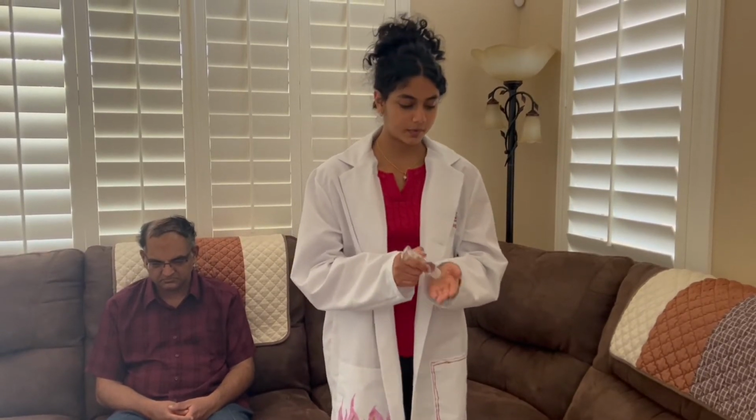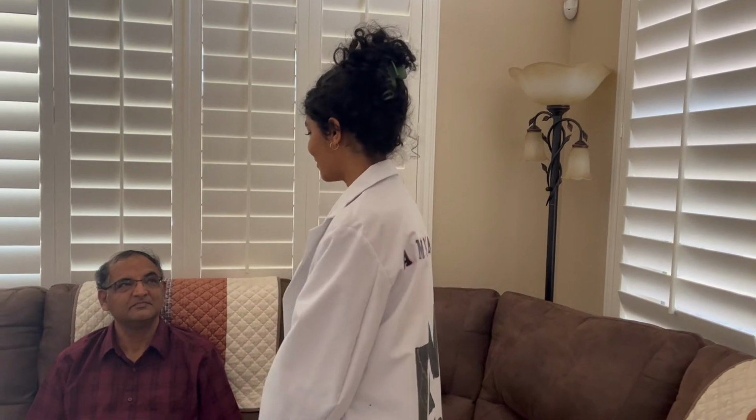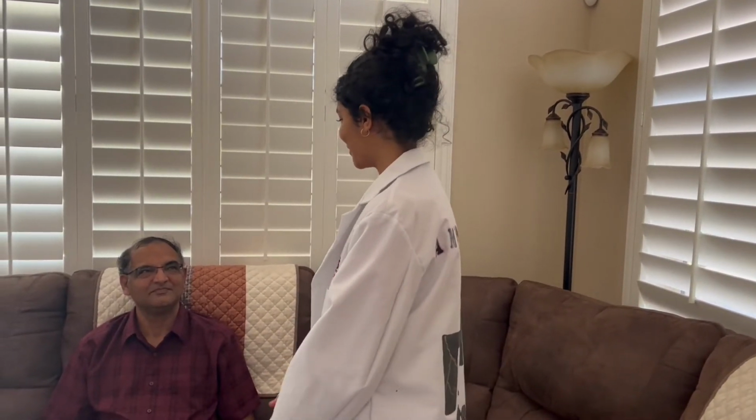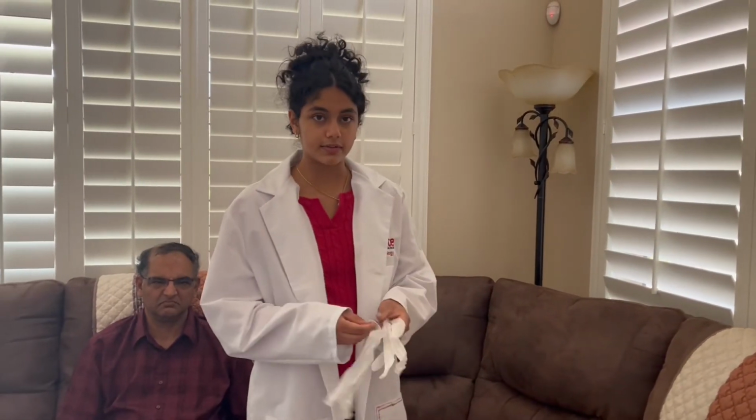First, wash or sanitize your hands with soap and water or medical grade hand sanitizer. Then, greet your patient. Hi, Mr. B. I'm Dr. Amanini. Today we'll be doing an eye exam for you. Would that be all right? Yes. Retrieve your tools and sterile gloves from a sterile surface.